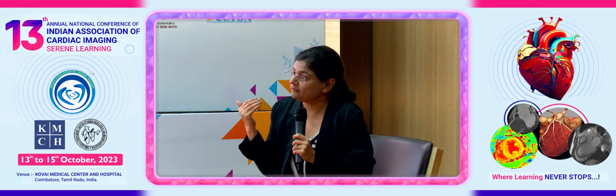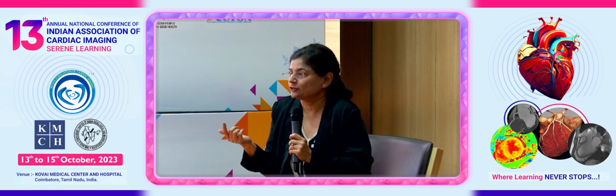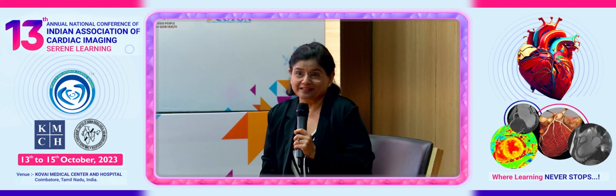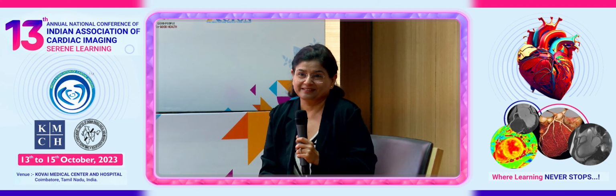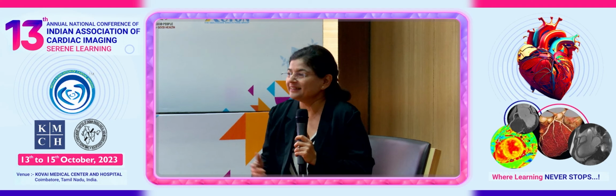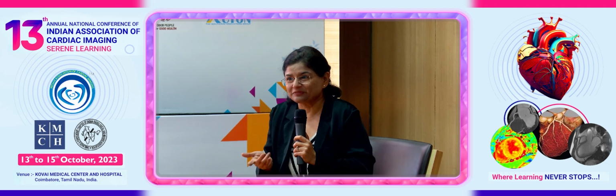And not only that, even the person who's sizing only takes one sequence. He only takes the post-contrast FLASH. He doesn't even have that porcelain aorta that you showed, Dr. Bala, so he doesn't even know where the calcifications are. He's just got one sequence. Yeah, absolutely. And then they look at me and say, which one did you get? Like, what do I put?